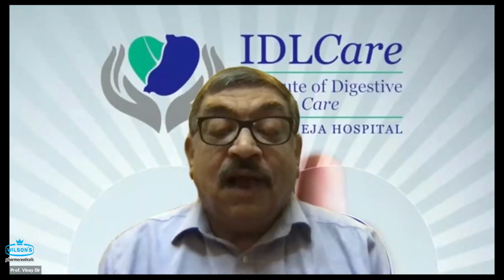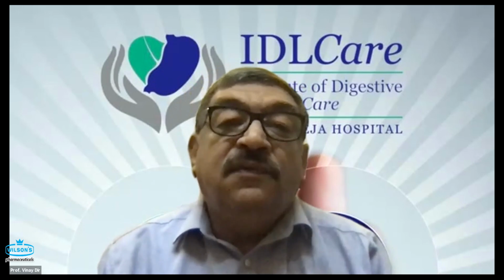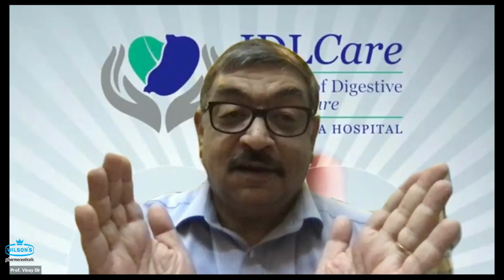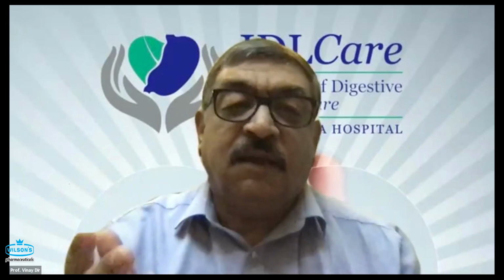So with all these precautions, I believe that if you have adequate expertise in ERCP and EUS biopsy, you will learn it quick. You will need probably 40 to 50 procedures, which is a long time for EUSBD. 40 EUSBDs means it will be probably a year and a half or 2 years maybe. So it's a learning curve. But again, my personal feeling is that if you branch out the advanced fellows into two branches, one learns ERCP and one learns EUSBD, the learning for EUSBD is faster compared to learning for ERCP. That is my feeling because I have done both.